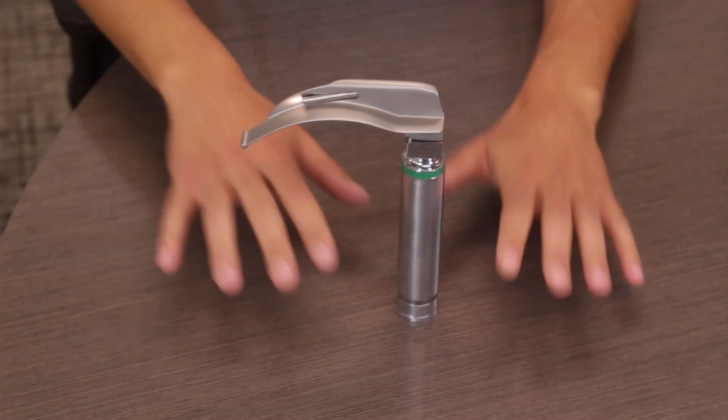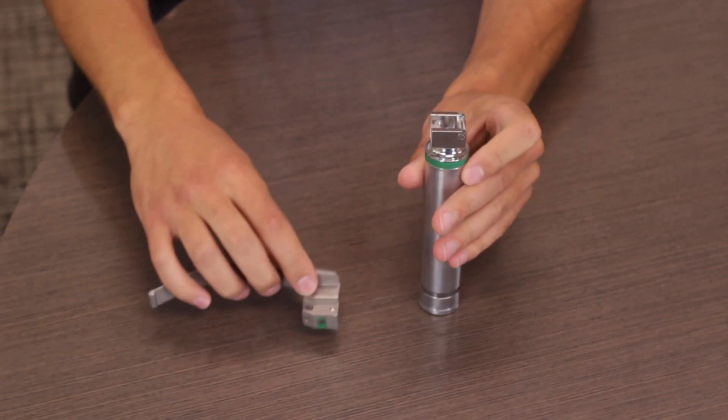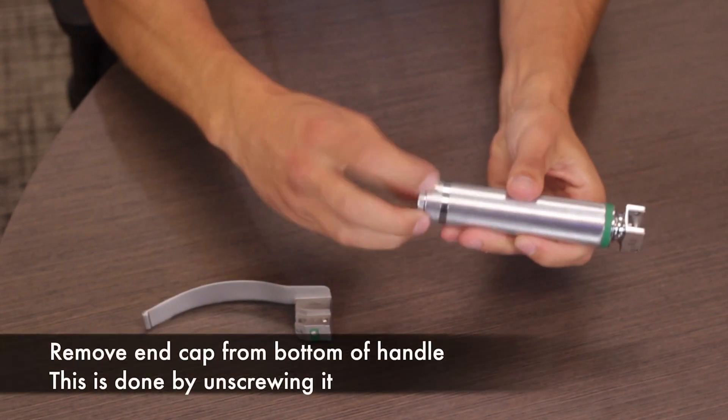Today I'm going to go over the recommended ways to disassemble and reassemble a SunMed reusable laryngoscope for disinfection and sterilization. The first step is to remove the laryngoscope blade — disengage and remove it. Next, simply unscrew the bottom portion of the laryngoscope handle.